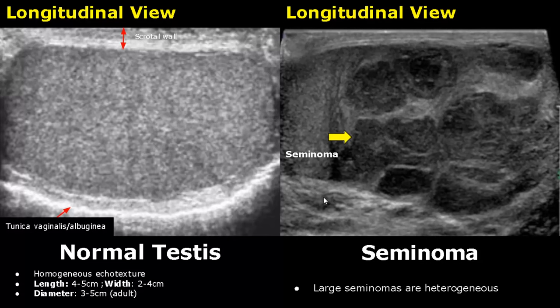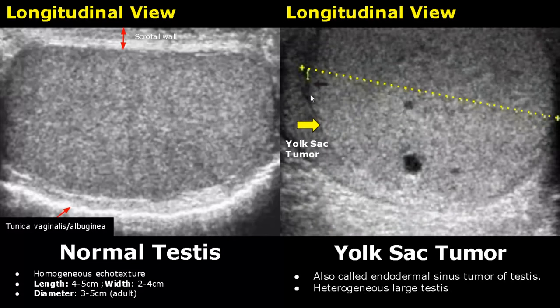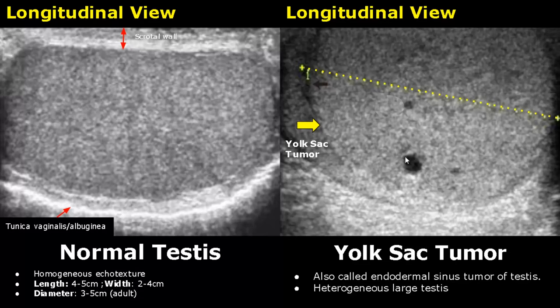A yolk sac tumor is the most common testicular tumor in children and is very rare in adults. It is also known as endodermal sinus tumor of the testis. It presents as a large heterogeneous testis.